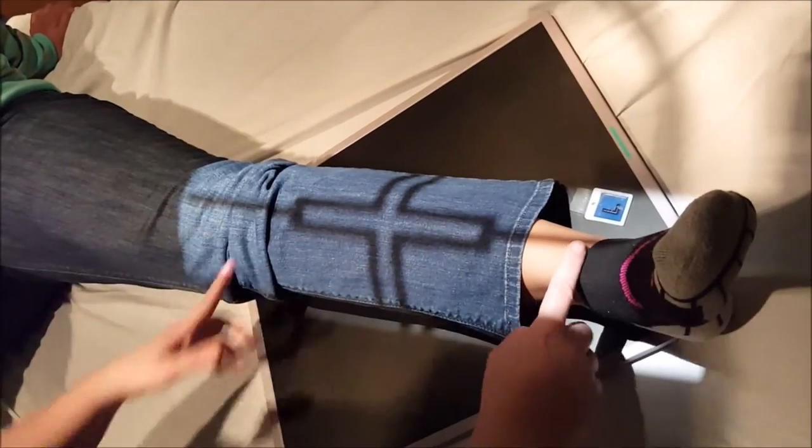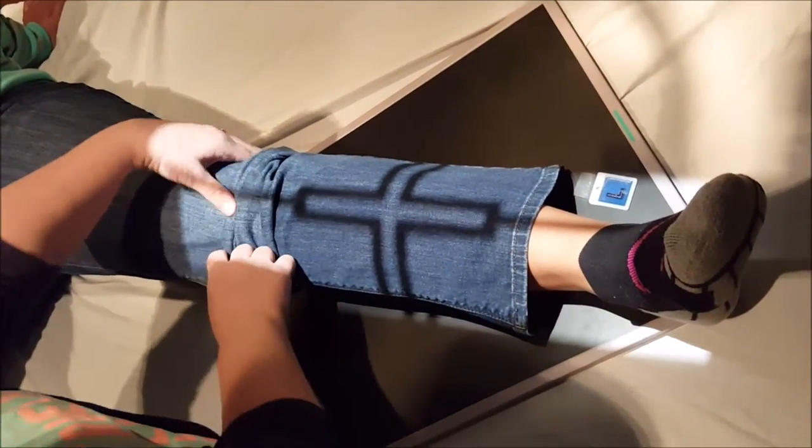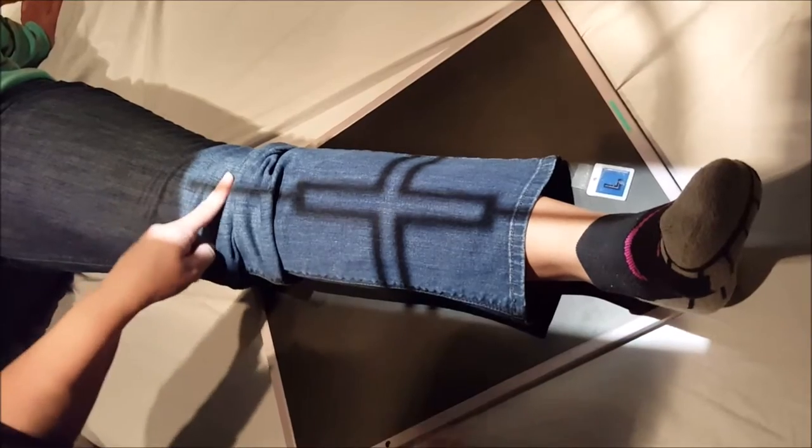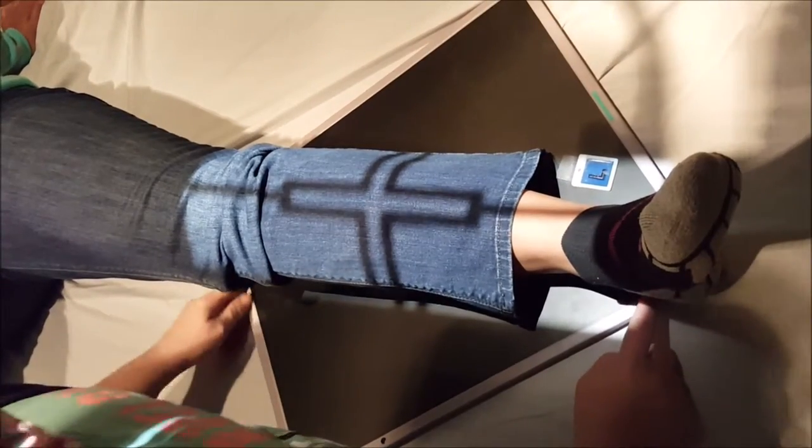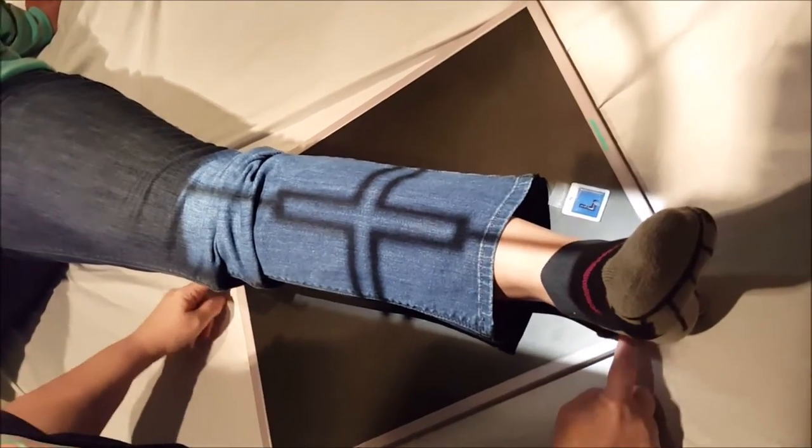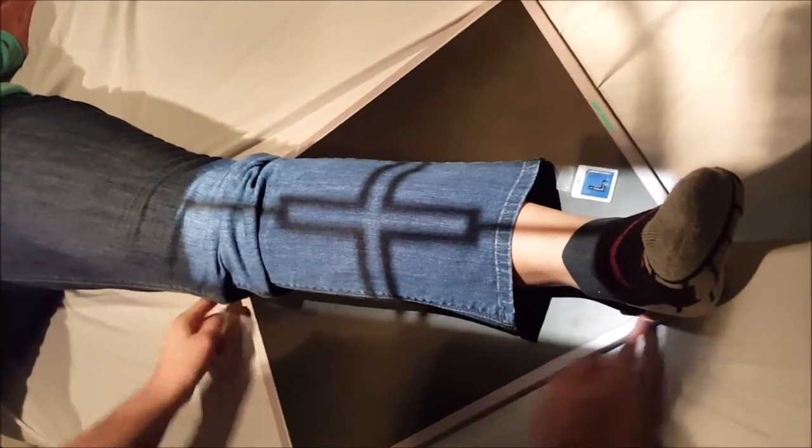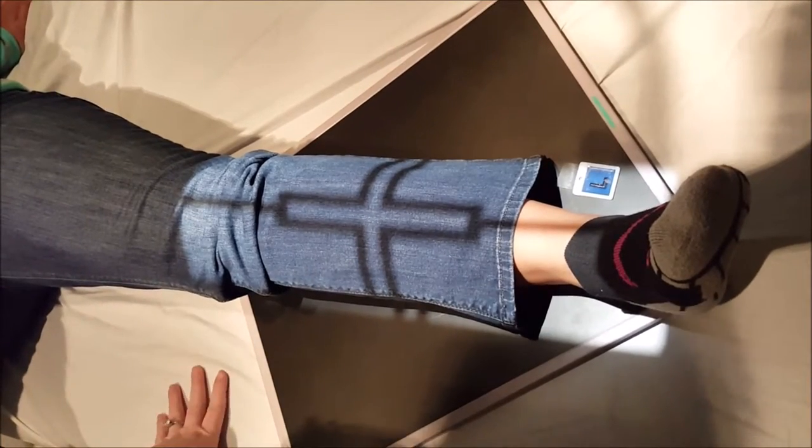We're still going to keep our marker on the lateral aspect. We do need to get from the ankle, so here's the malleolus, so I know I'm going to get the ankle, and here is the apex of her patella, so I know I'll get the knee. So I'm going to collimate so that I'm actually just on the board. So here's the corner of the board, and here's the corner of the board.